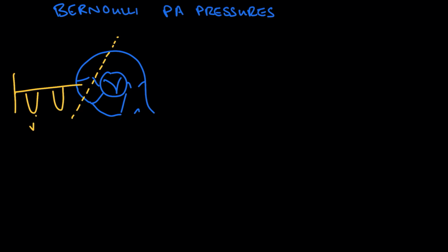We can take this Vmax, the regurgitant velocity, and use that to estimate the RVSP. And again, this is sometime in systole. I'll just draw it, somewhere right about there, let's say. And the formula, if you recall, we have our high pressure, which is our right ventricular systolic pressure, that's our pressure in the right ventricle, minus our right atrial pressure, which we'll get just looking at the neck, jugular venous distension, is equal to 4 times our velocity of the tricuspid regurgitation squared.